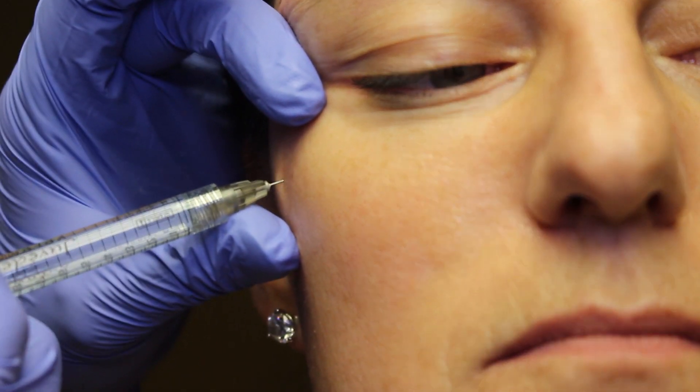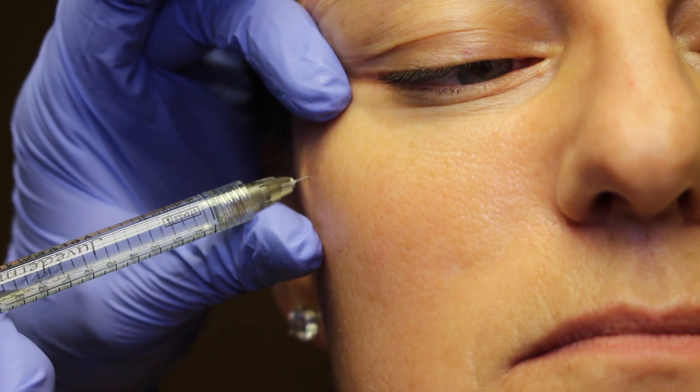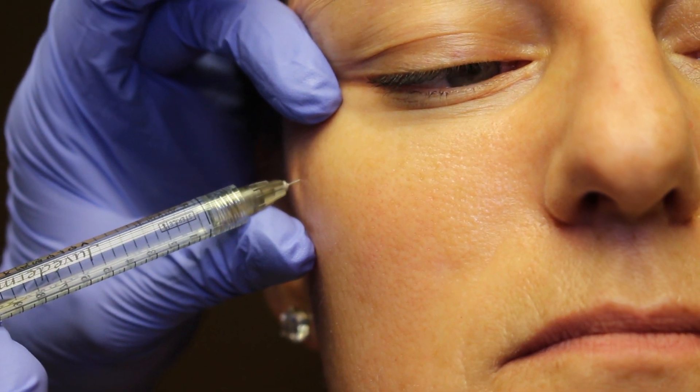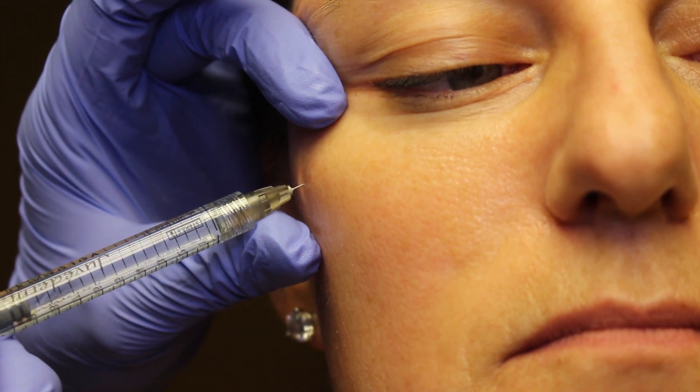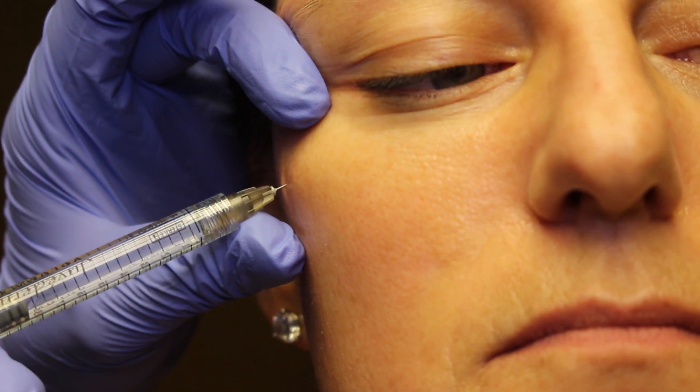The nice thing about the HAs is you can gently and slowly aspirate. You can see there's a little bubble there, right there at the tip — waiting for the bubble. And that means we're not in a vessel, so now I can go ahead and inject just a little bit of product. This Voluma has lidocaine, so I'm going to go through this area to use the cannula as well.